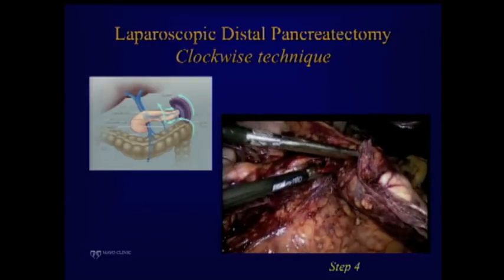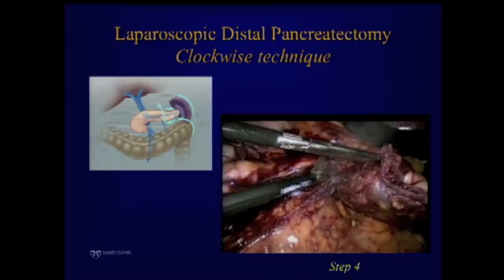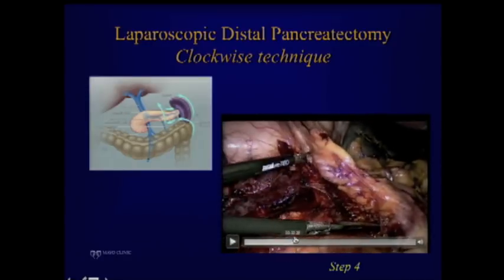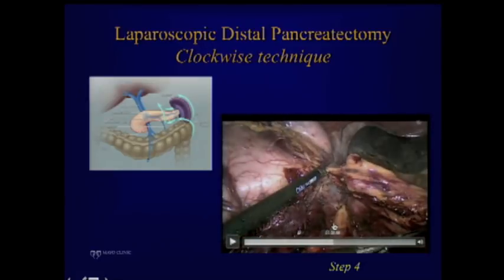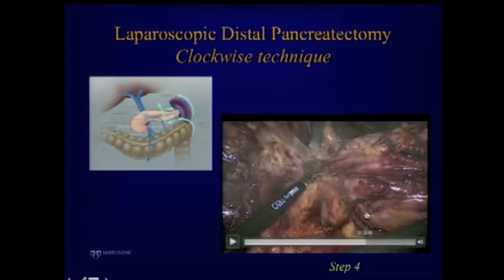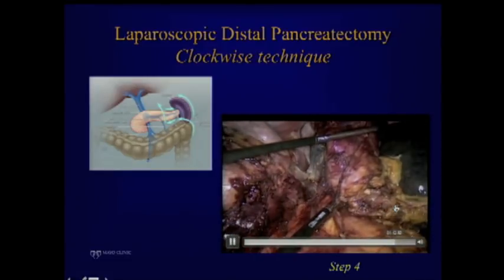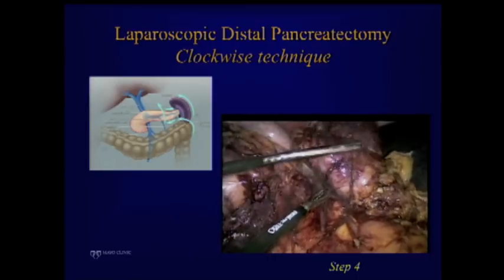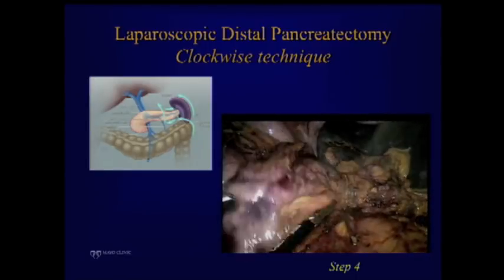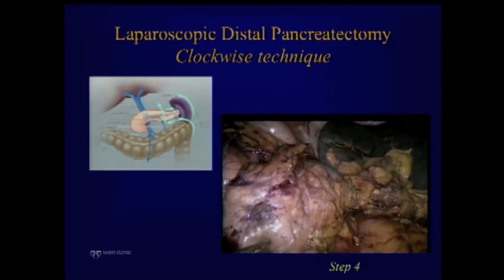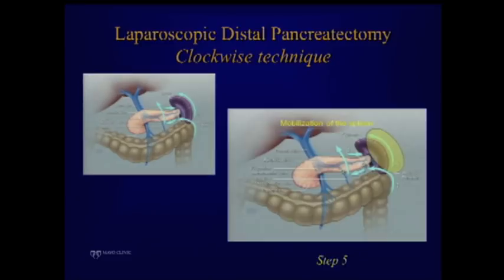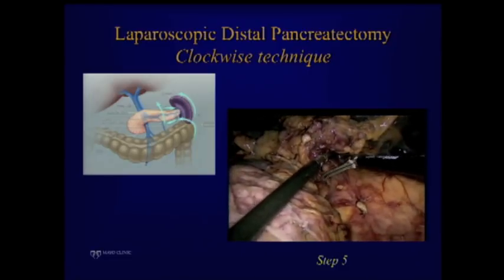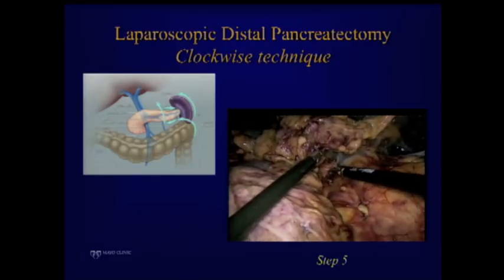The next step comes from right to left superiorly. On a subtotal case we isolate the artery and vein; if it's not subtotal, you just do the retraction and separate the last part. Your whole specimen is completely freed except for the area of the spleen. The trick we use is putting a large intestinal clamp lifting the pancreas up — the surgeon's hand is up here, the other hand down — exposing the posterior part of the pancreas. The last step is taking the spleen out, similar to a standard splenectomy.